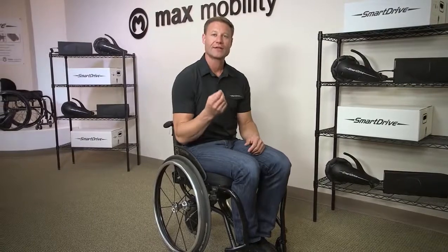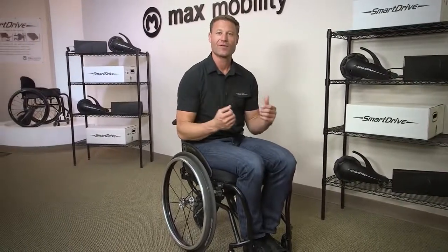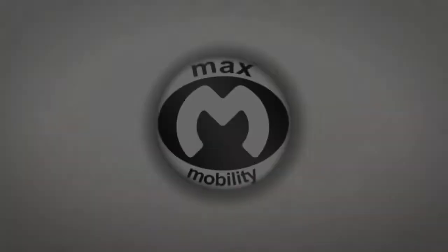Crashing your wheelchair can result in serious injuries to yourself and others. To prevent accidents, practice conservative driving. Choose to press a button and stop the motor whenever approaching an uncertain situation or environment. It's always better to be safe than sorry. By making careful driving choices, the SmartDrive will greatly enhance your mobility and give you the freedom to go further than you've ever gone before.